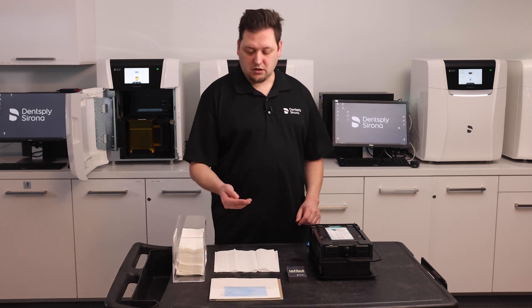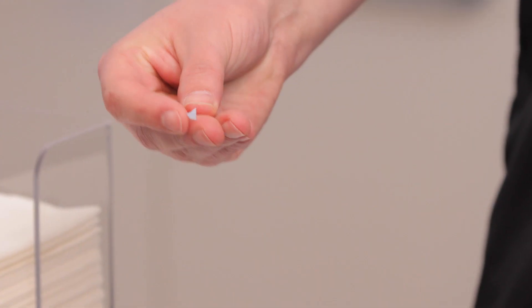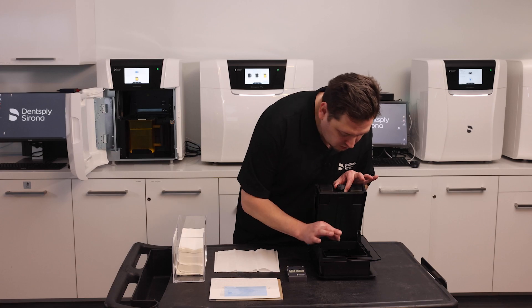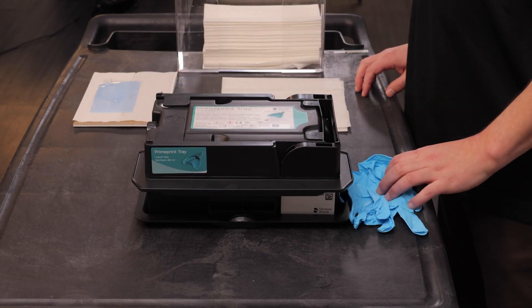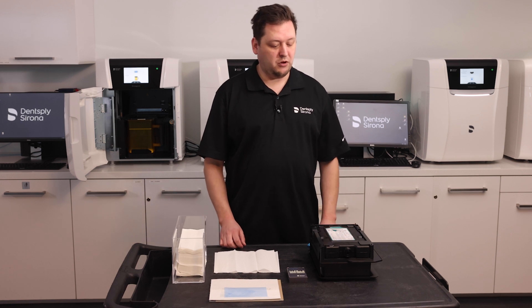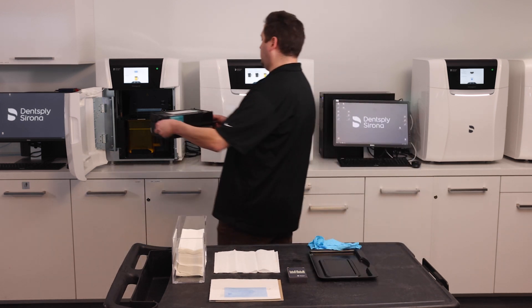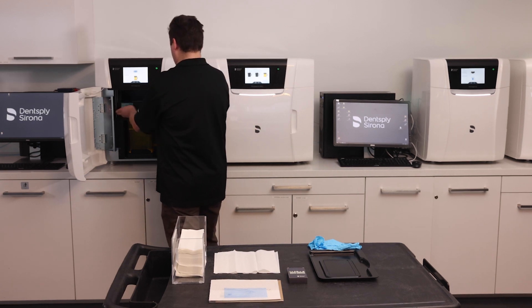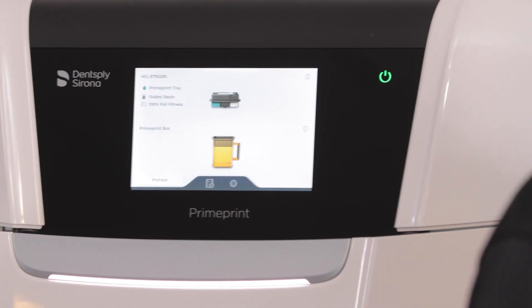To demonstrate, I'm going to take a support from a previous print job — very small — and actually put it into my material vat. Here's how we print that cleaning layer. I take my material unit, put it inside the prime print, latch it closed, and close the door.